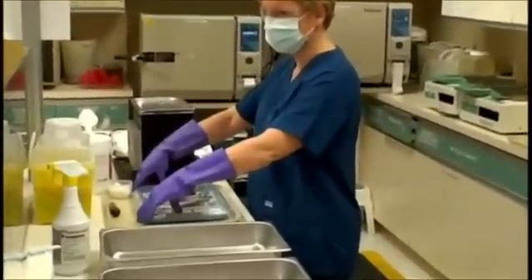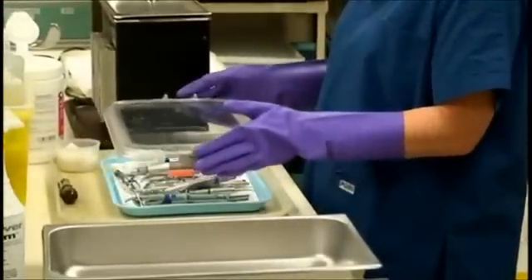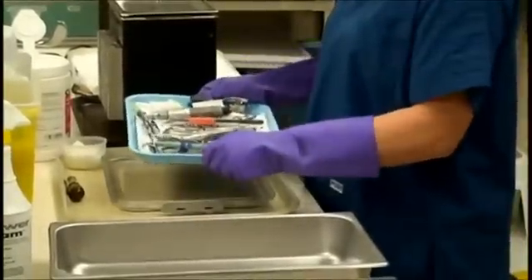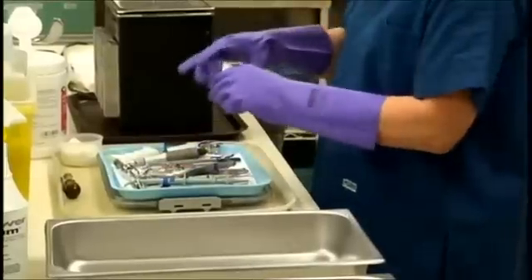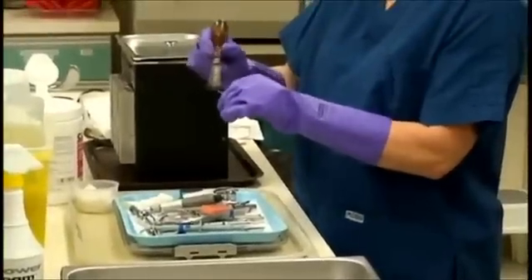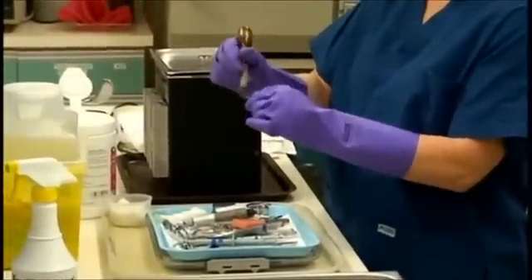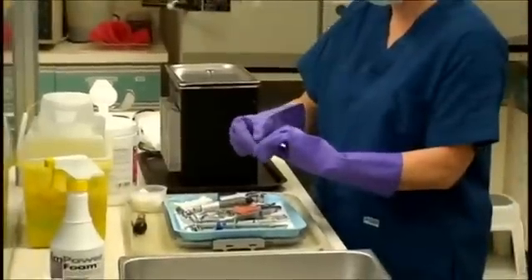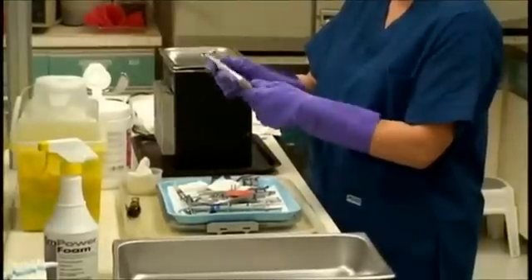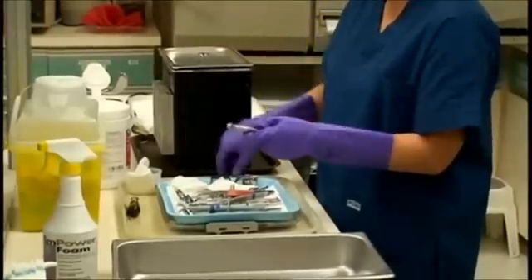Place the tray on the island counter on the contaminated side of the counter. Clean the dirty burrs that are in the plastic burr block with the burr brush. Take the burrs out individually to thoroughly clean each one of them. Wipe hand pieces with a wet 2x2 gauze. Place hand pieces and burrs in the statum cassette.